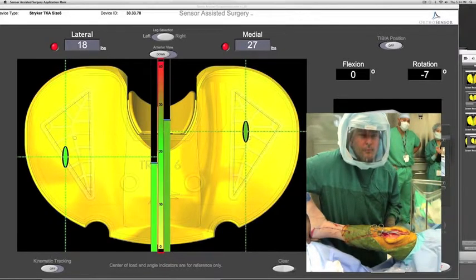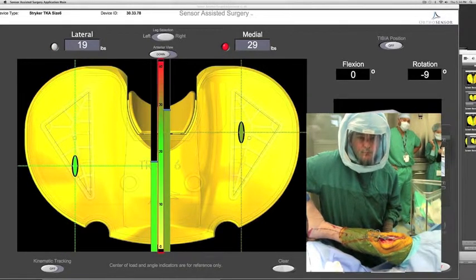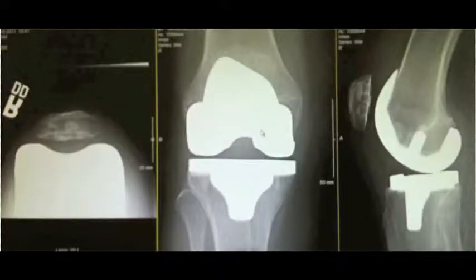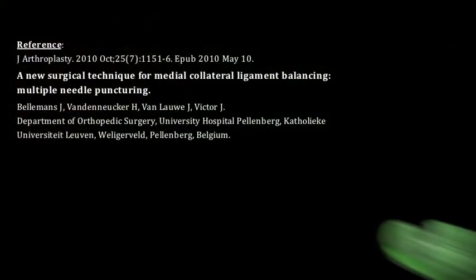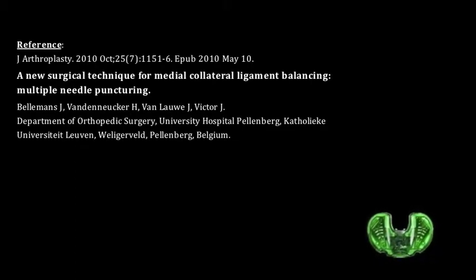Utilizing intraoperative real-time dynamic data, the surgeon can minimize the soft tissue dissection while optimizing the patient's intercompartmental balance through a full range of motion. By optimizing limb alignment, femoral and tibial rotation, and soft tissue balancing techniques, it is felt that improved kinetic function of the knee in the postoperative period will be seen with long-term follow-up.